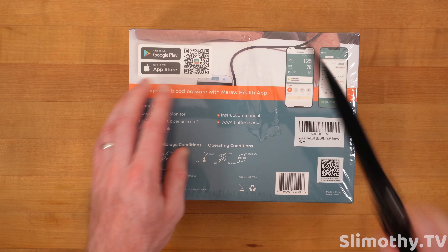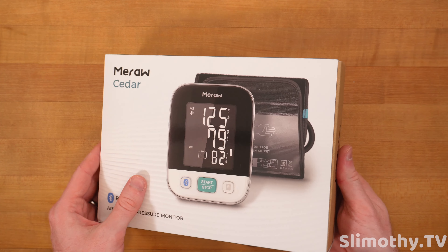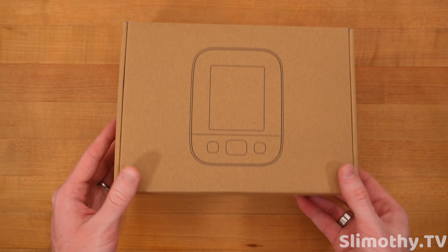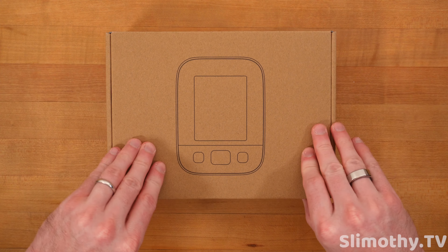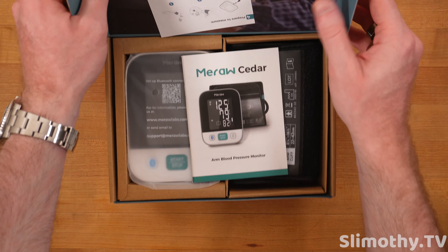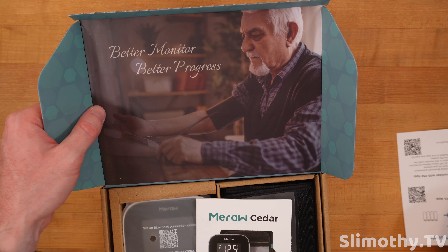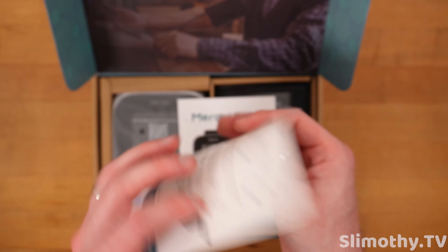Let's crack this box open. Let's go ahead and open this up, slide this out just like so. Wow, this is a better unboxing experience than Apple products, that's for sure. We are immediately presented with a very nice box — 'Better Monitor, Better Progress.'